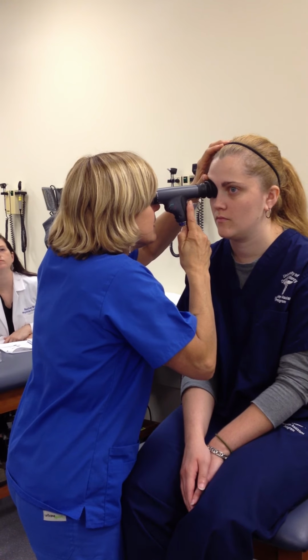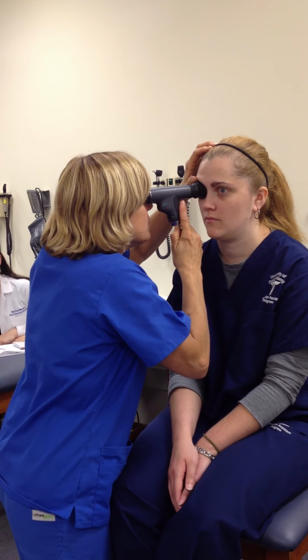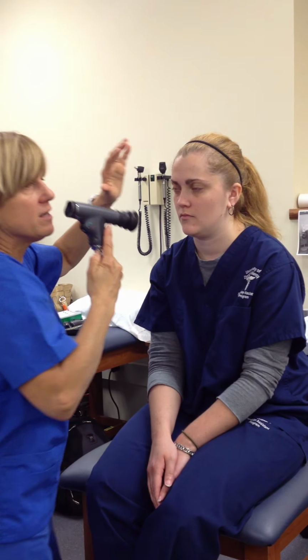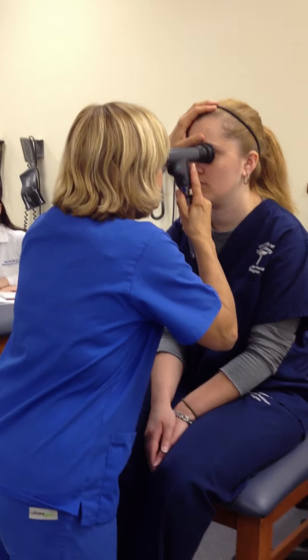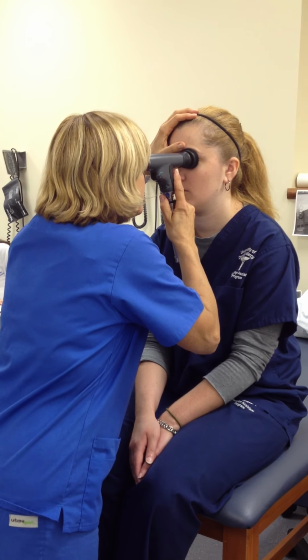make contact, and now I'm looking at all the structures I just named, and you can just hold your position here, and then you come out, and then you don't have to switch hands or anything. You can just come right over here and do the same thing. See the red, and then come straight in, drive straight in, and I'm looking at all the same structures.